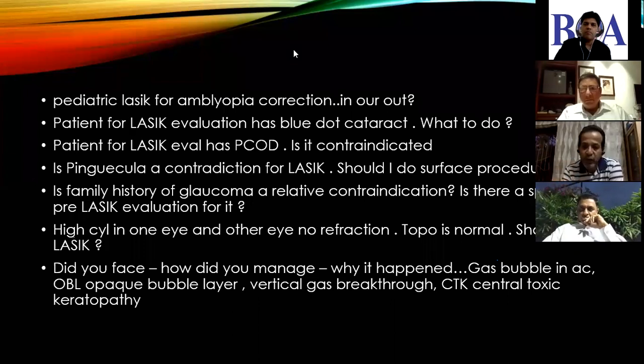The first and foremost is do not lift the flap. Make the patient wait for about an hour and a half. After that, in all probability, you will see the air bubble getting absorbed and one can go ahead and do it. As long as the air bubble is not in the center blocking the pupillary aperture, there is no harm doing it. Okay, thank you.